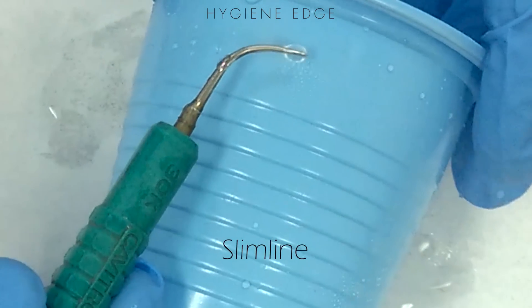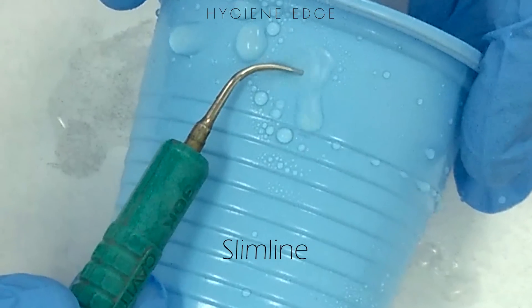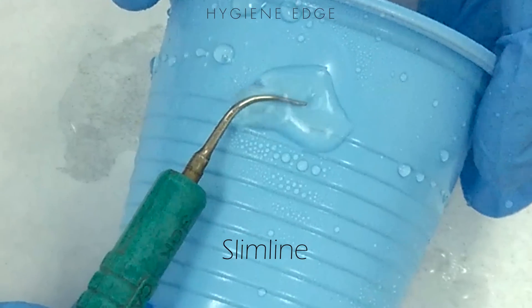This green tip has lost a lot of its length, so it takes a lot longer to make a hole. So this tip needs to be reordered.